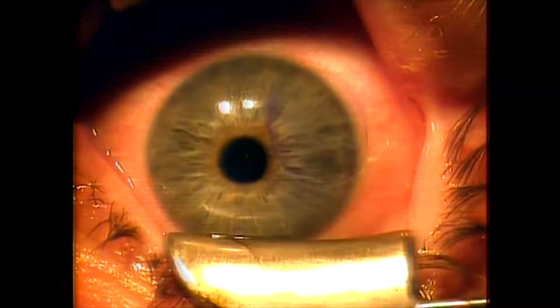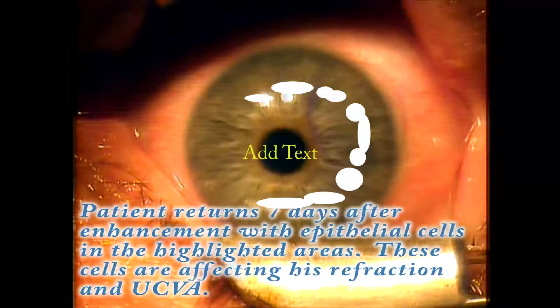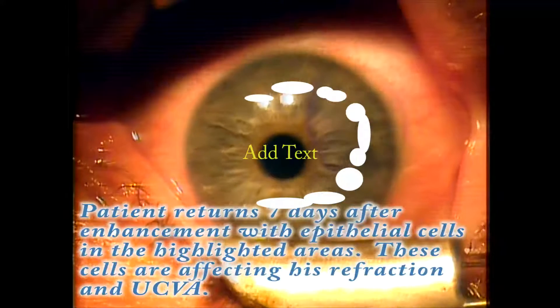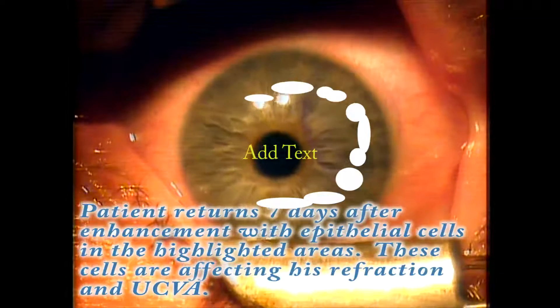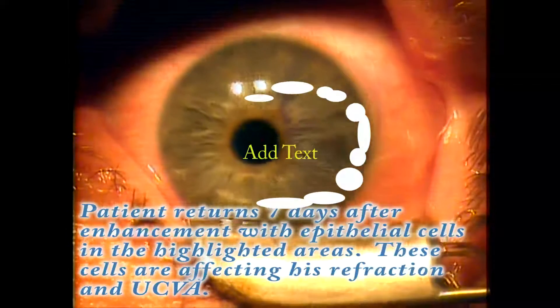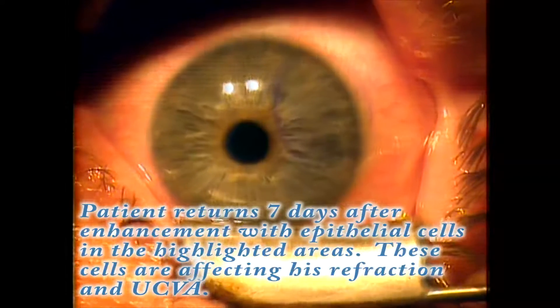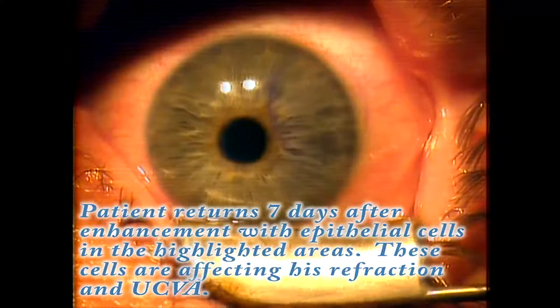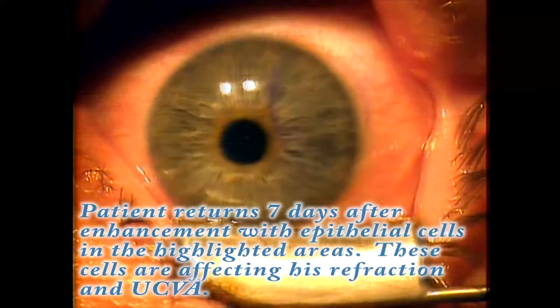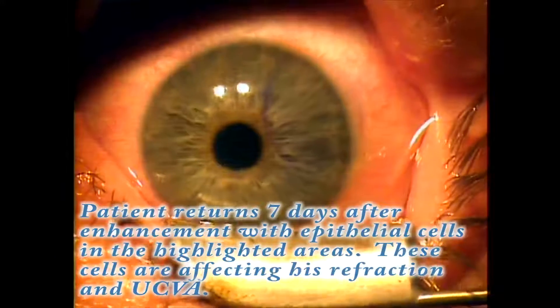This patient did well until one week later when he started noticing some blurriness to his vision, and when we looked at his eye through the slit lamp we could see epithelial cells growing, as highlighted here in white. These cells were affecting his refraction, which was plano the day after surgery, and he became more hyperopic over the following six days. It also affected his uncorrected vision. So we confirmed the elevation at the periphery and the distortion of the mires on corneal topography and elected to re-lift his flap.